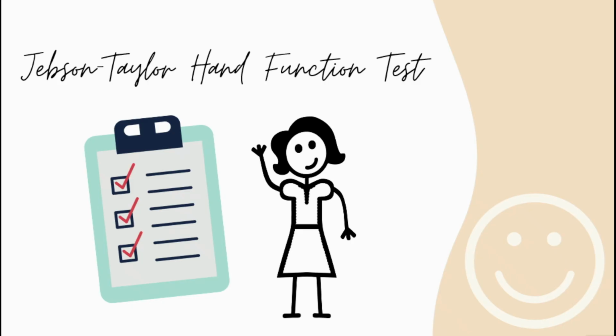I hope this video provides you an insight as to how the JHFT hand function test is completed and who it may be appropriate for.